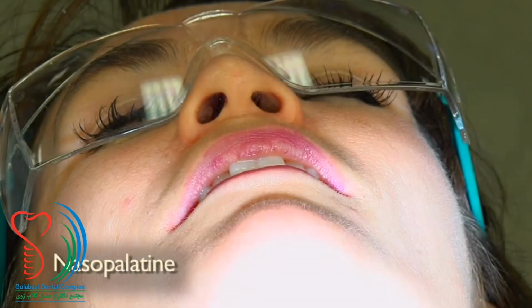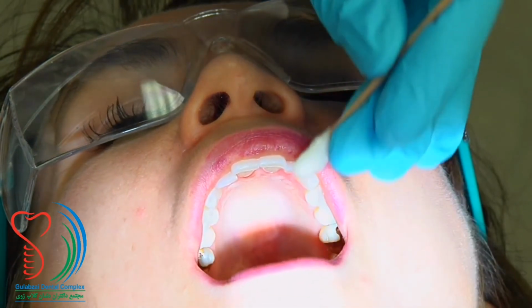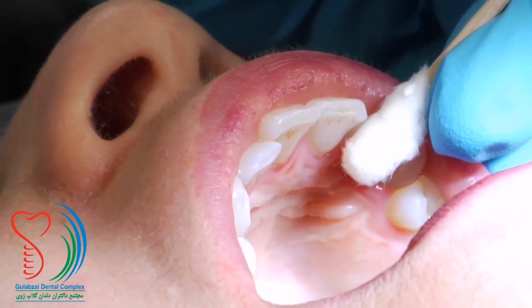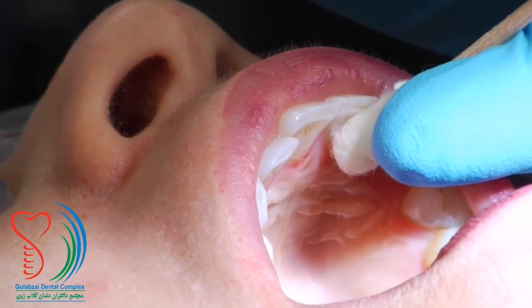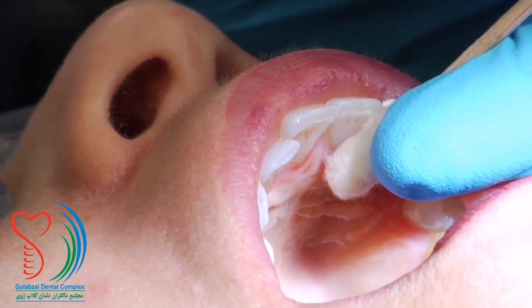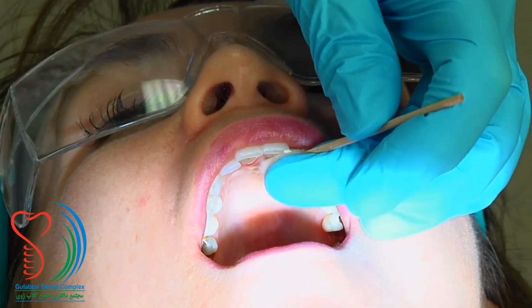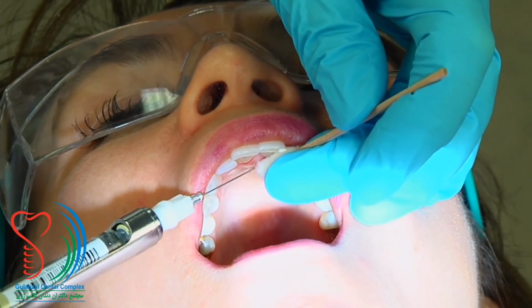The nasopalatine is done in a similar manner. The insertion point for the nasopalatine is at the junction of the incisive papilla and palatal tissue on one side or the other of the incisive papilla. After you apply your topical to the penetration site, again with a cotton swab, exert firm pressure to cause some pressure anesthesia, laying the bevel of your needle as close to the pressure point as possible.